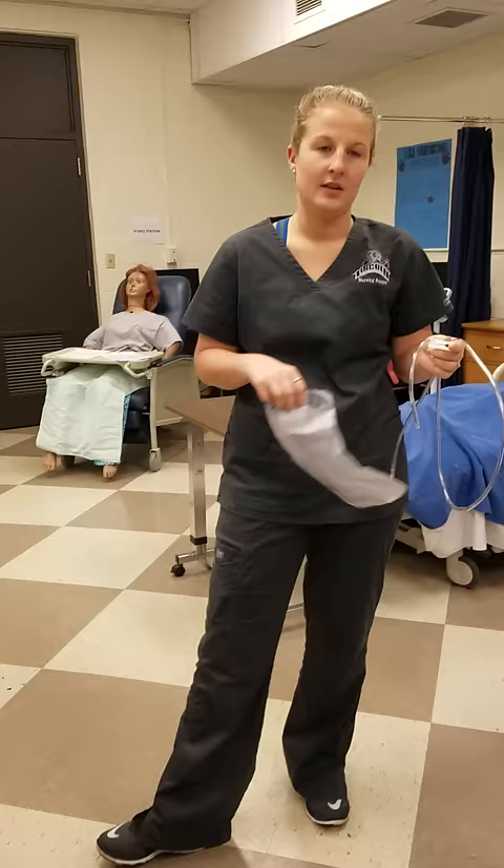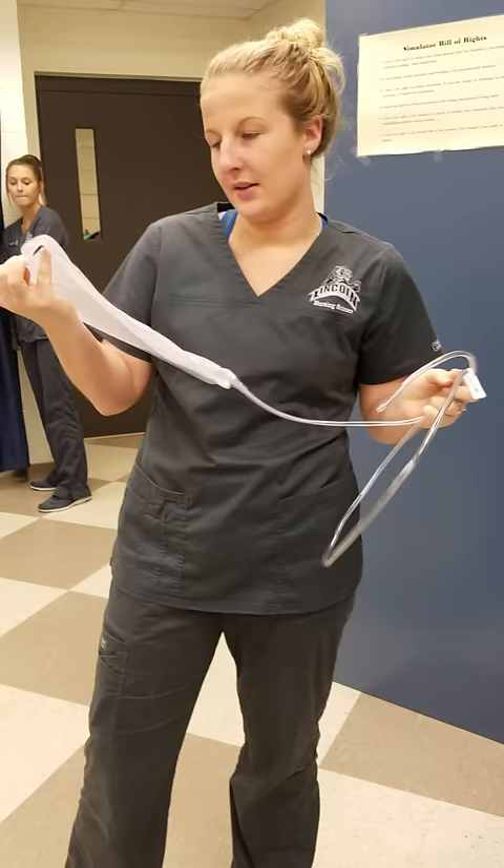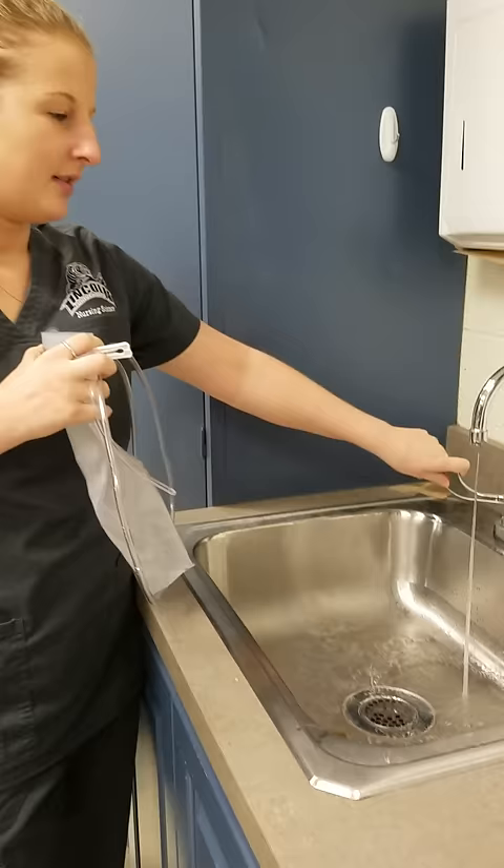I'm going to make sure that I have all my supplies gathered. I'm going to go fill up my enema bag to between 500 and 1,000 mLs and get started. I'm going to have lukewarm water, not too hot and not too cold.